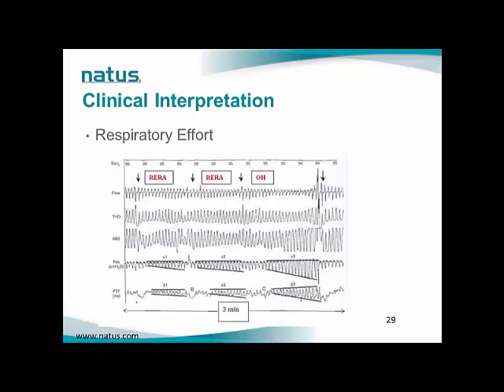PTT can be used to analyze respiratory events and specifically to detect hypopneas, upper airway resistance syndromes, and central events. Because the heart and the vessels are located in the thorax, these organs can also be affected by variations in the thoracic volume and pressure as a result of breathing. As the thoracic pressure increases, the heart is compressed and blood pressure increases and PTT shortens.